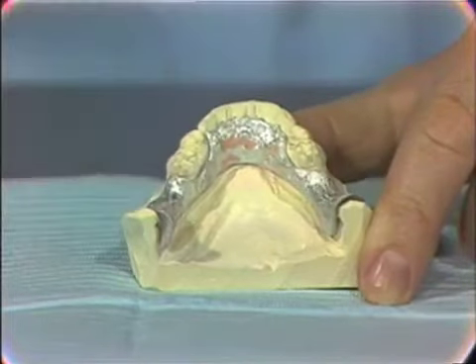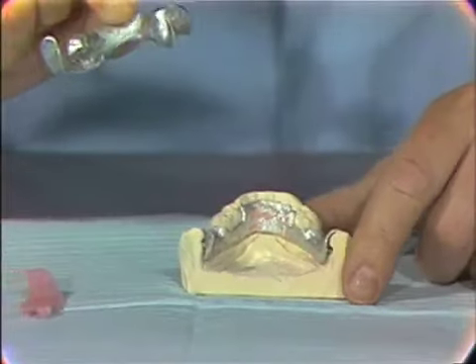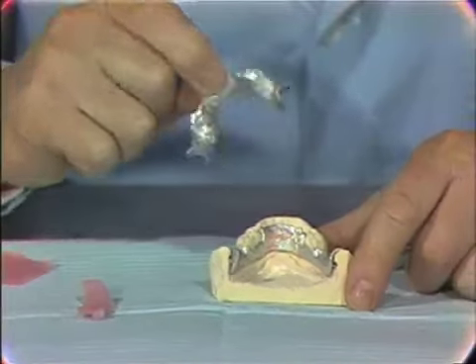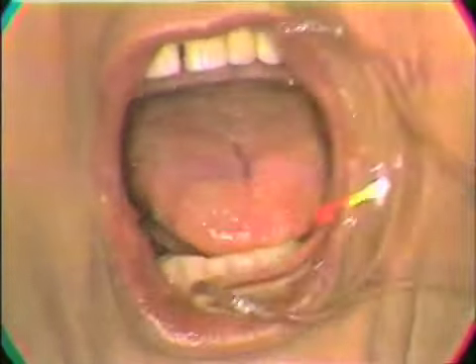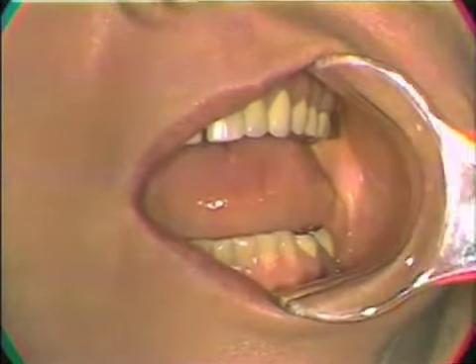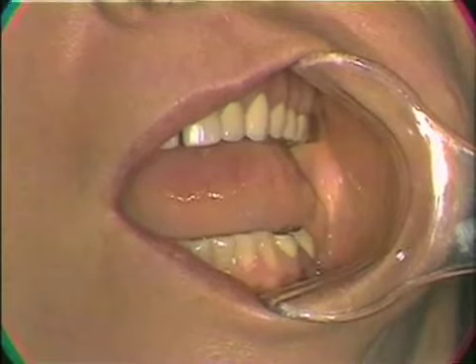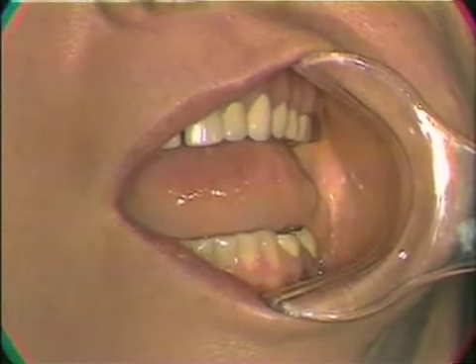So we have the impression tray. We now go to the mouth, practice with the patient on how to insert the impression tray. Open, please. Now, the procedure for taking the impression involves certain things that the patient has to do as you place the tray in the mouth. And you should practice with the patient before you take the impression.